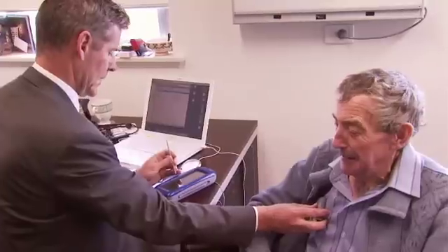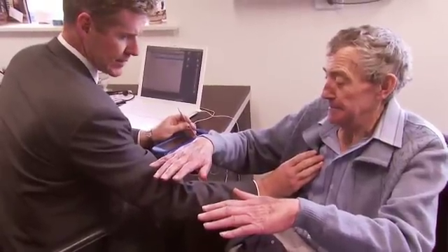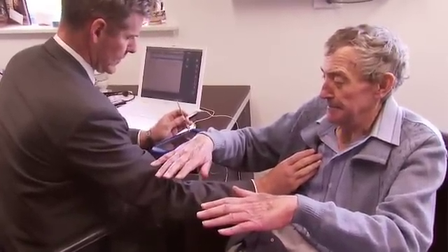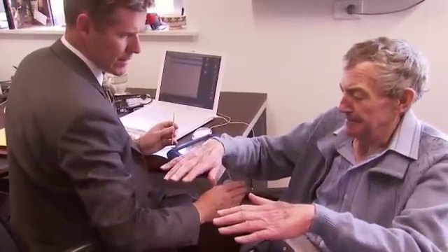Parts of the brain that we're delivering an electrical current to are thought to be participating in the circuitry involved in Parkinson's disease, so what we're effectively trying to do is disrupt that process. By affecting what goes on in one part of the brain, we can influence the pattern of activity in various other parts of the brain, and that can have a positive benefit on their underlying condition.